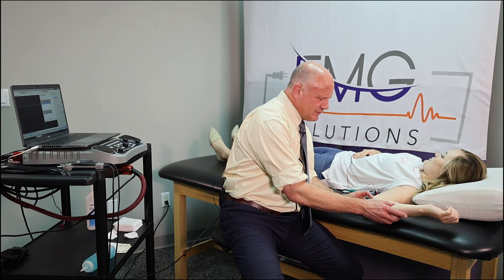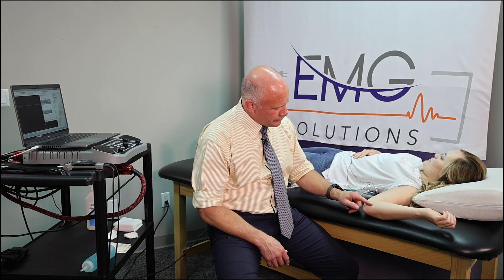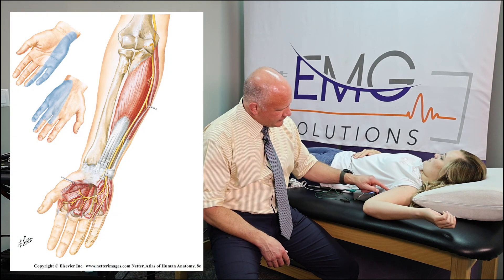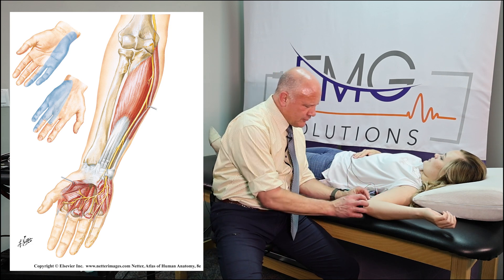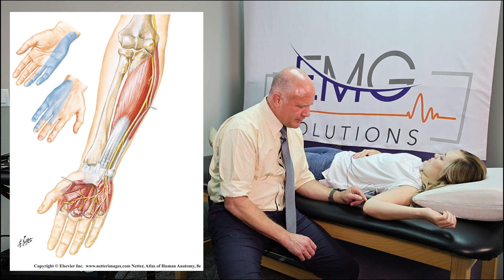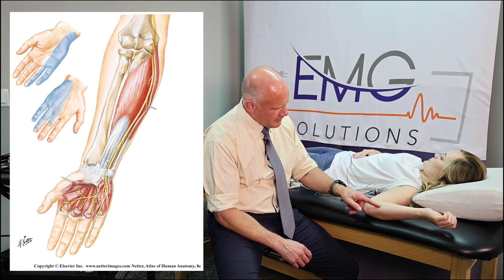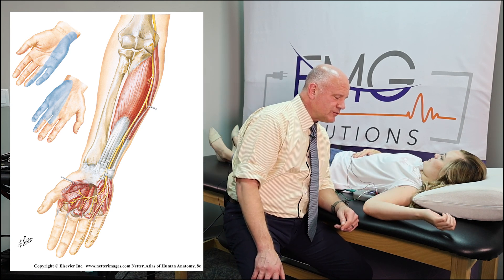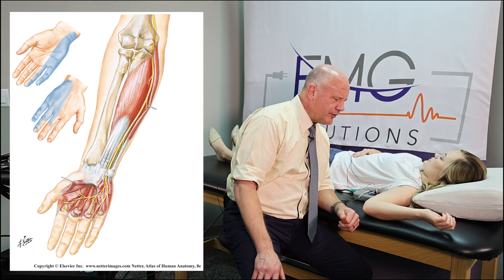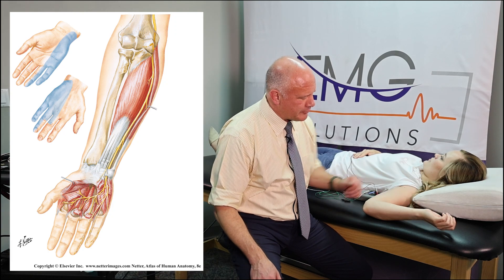We've got the elbow bent to about 90 degrees. The reason we do that is because we want to make sure that we remove any slack in the ulnar nerve as it comes across the elbow. It passes behind the elbow — you can almost see the medial epicondyle — and the nerve comes right behind that epicondyle through the cubital tunnel, then into the forearm and down the ulnar border into the hand, providing distribution to the muscles including the hypothenar eminence and most of the intrinsics of the hand.